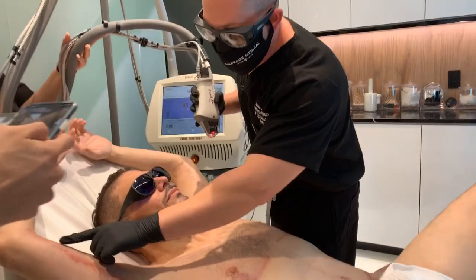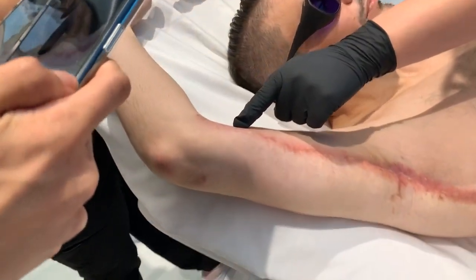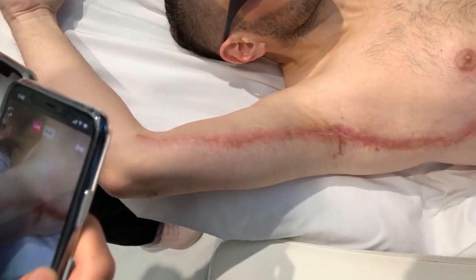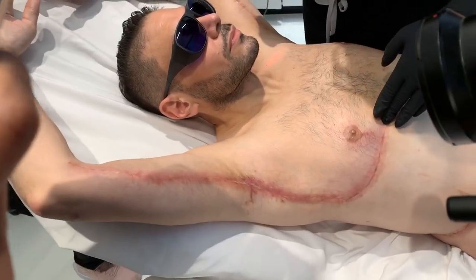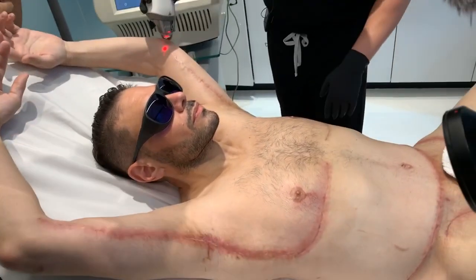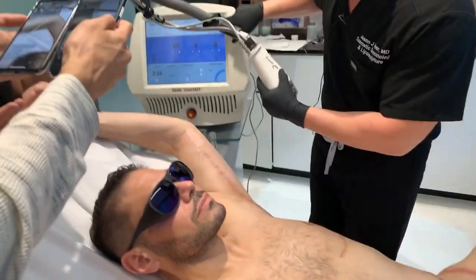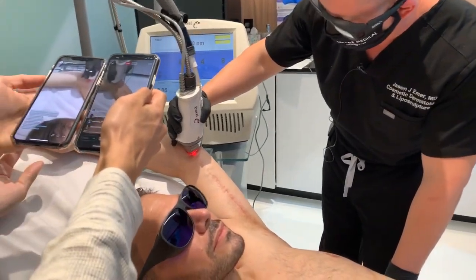Zoom in right here, you can see a lot again of that Fraxel. You can see the dots that are in the skin. Fraxel is a non-ablative laser. There's two different types on here. The deeper setting that we're doing right now for scars, and I'm going to show you guys on here, doesn't really hurt that much. Hold on 1 second, let's get ready. Doesn't really hurt that much, but develops a lot of heat.